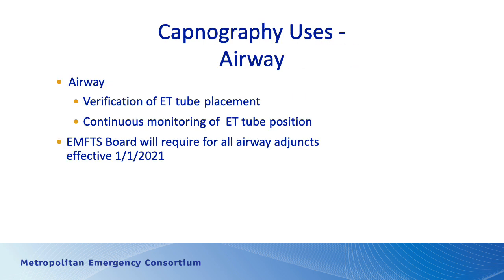For airway, we can use it to verify endotracheal tube placement, and we can use it to continuously monitor endotracheal tube position. I think if we use an endotracheal tube or an iGel or any other type of airway device in the field, we are obligated to monitor the patient with capnography.